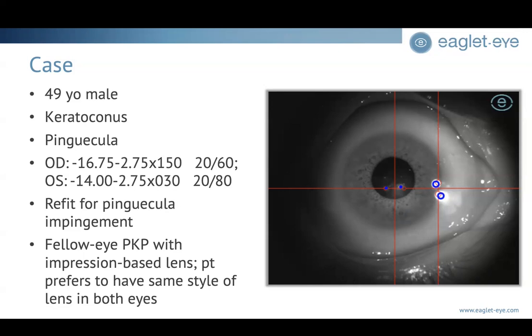So we brought him in to fit him with an impression and a profilometry image. Often what I'll do with a lens design, if I'm going with a free form lens that has an option for an impression versus a digital scan, I'll take both. Specifically in this case, it was an iFit lens. Whenever we have access to two pieces of data, two is always better than one.